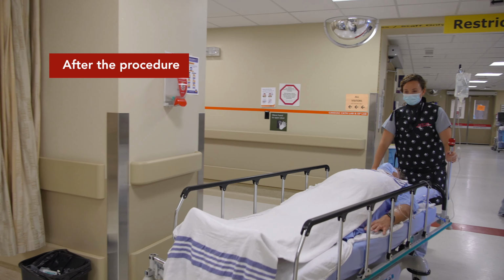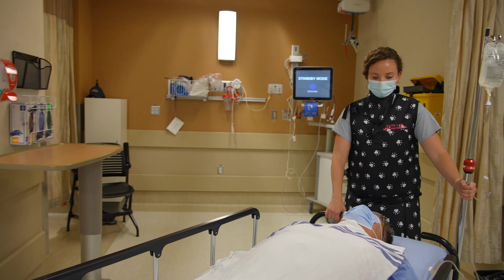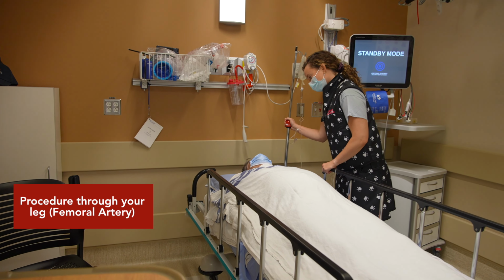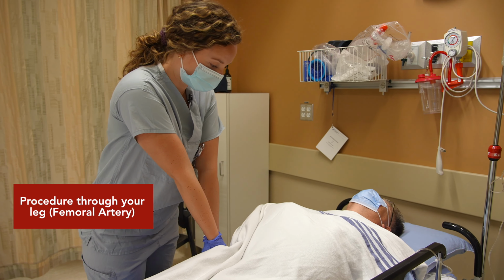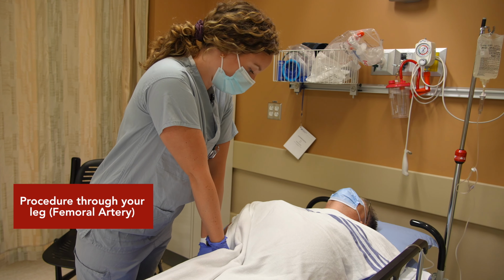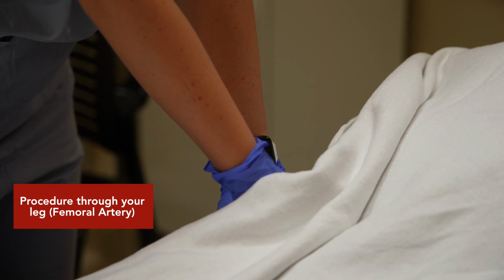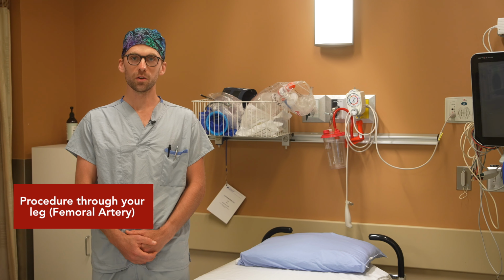After the procedure, the cardiologist will leave the room and the nursing staff will begin your post-procedure care. If the procedure was done through the artery in your leg, the cardiologist may leave the tube or tubes in place to be removed in the recovery area. When you return to the admitting area, a nurse will remove the tube or tubes while holding firm pressure on your upper leg. This takes about 20 minutes and allows your body to form its own blood clot to start healing the hole. In some cases, the cardiologist may decide to insert a plug or stitch into the artery to close the hole.